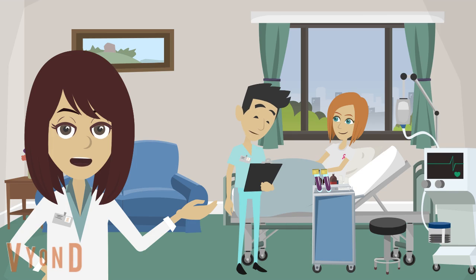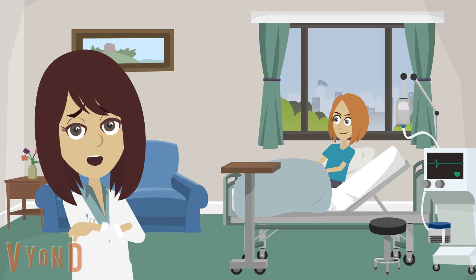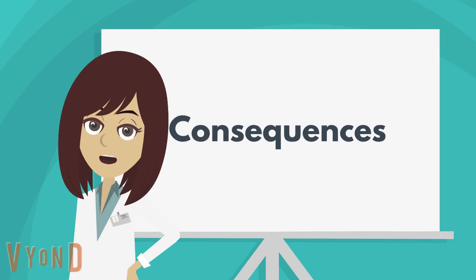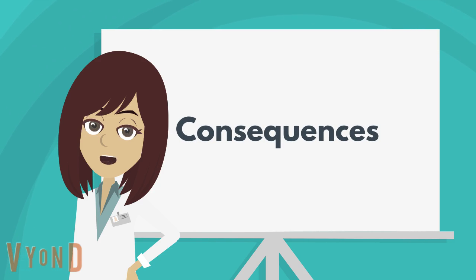Sometimes mistakes are made. Here we have a nurse about to take blood from a person he thinks is the correct transfusion patient. Unfortunately, the correct patient is in the next room, and although they have the same first name, this does not mean they have the same blood type. Pre-analytical errors such as these can have severe consequences for patients.